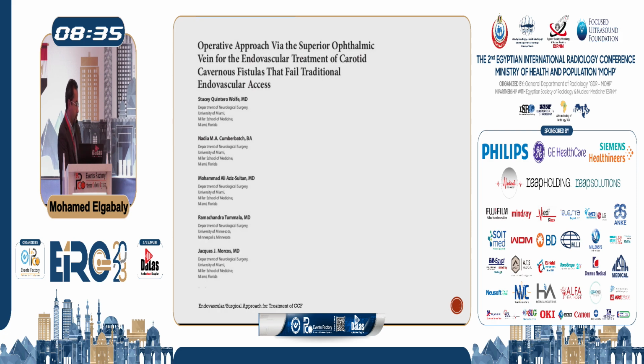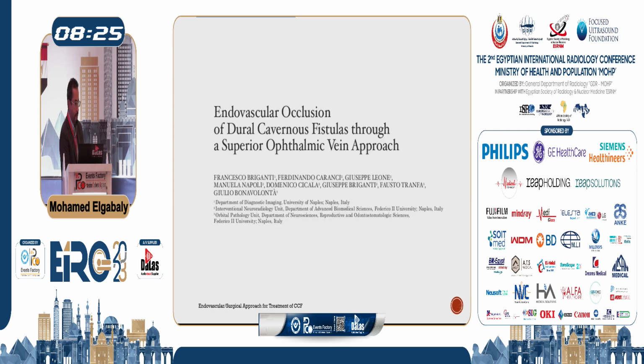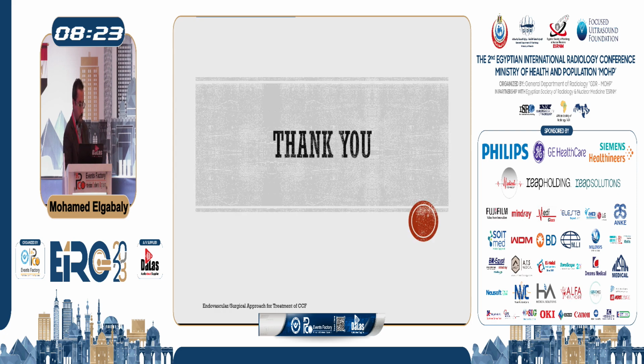There are a bunch of papers out there. They all quote almost complete cure, or at least 90% cure, extremely low chance of complications, and it kind of proves the point that the ophthalmic vein may provide a safe access to treating carotid cavernous fistula. Thank you very much.